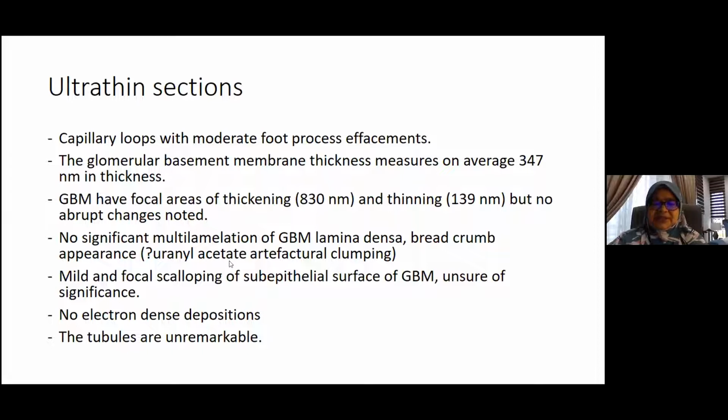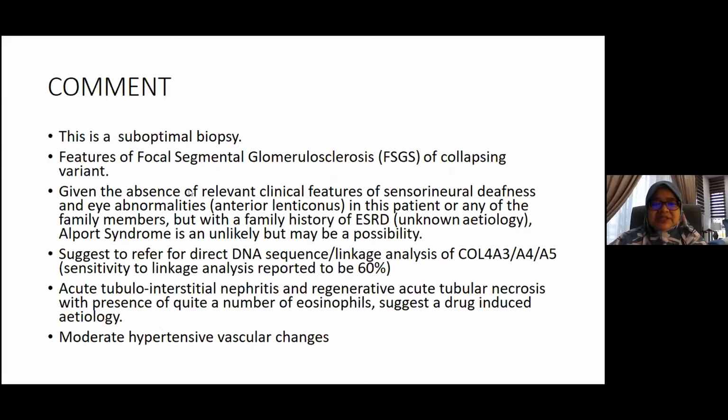No significant multi-lamination of the lamina densa or breadcrumb appearance, and there's some scalloping, though I'm unsure of the significance, but all in all, it's not enough to call it Alport syndrome. Okay, and this is also a suboptimal biopsy.